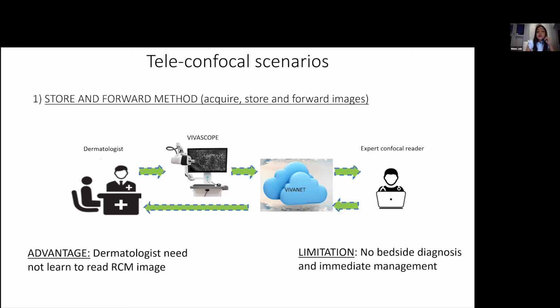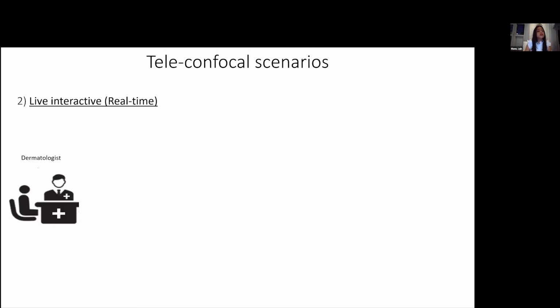However, the problem is this expert might not have time immediately to look at these images, and by the time the report comes back, the patient has gone. So there's no immediate management there, and it just defeats the purpose of confocal microscopy. Our approach is live interactive, which I'll show you very quickly.